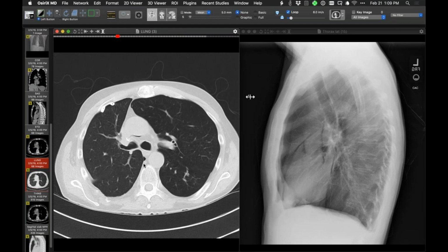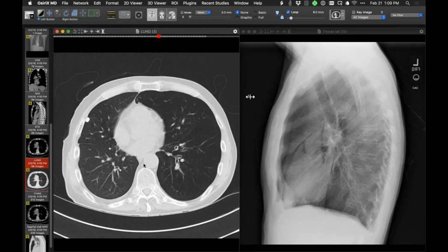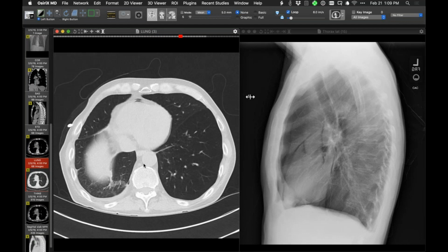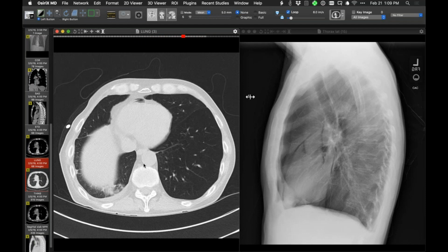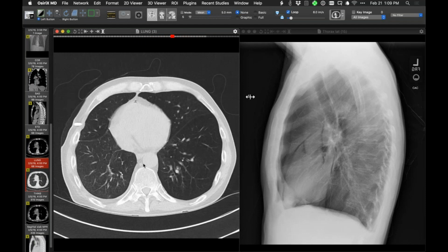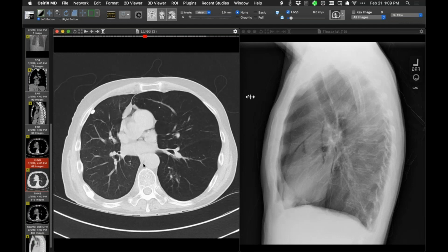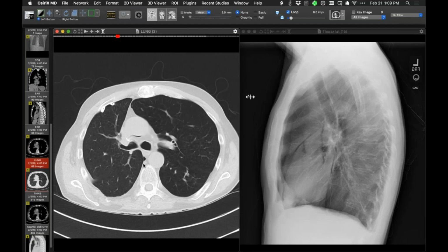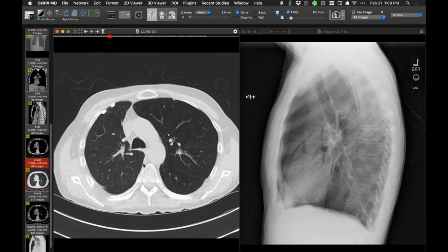I didn't think about that, but now that you mention that, I think the anatomy could well be that. In a general sense, if one has Pneumomediastinum and pleural space air post-transplantation, it's possible that there's often disruption of the parietal pleura, right?